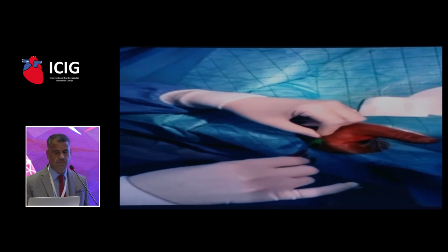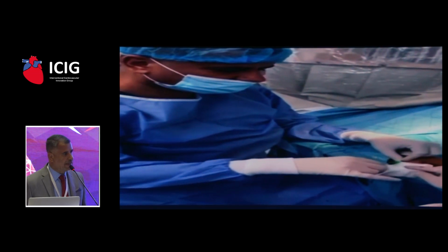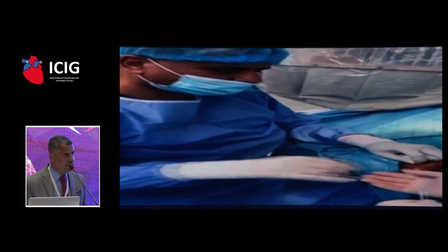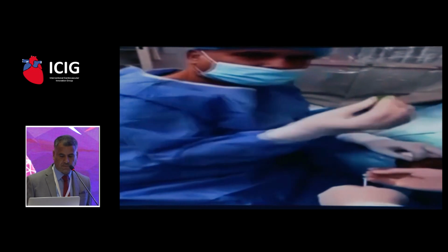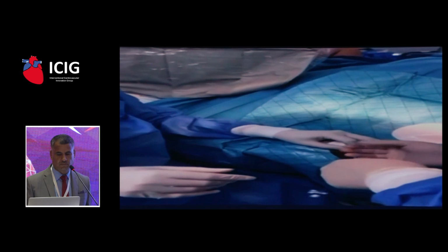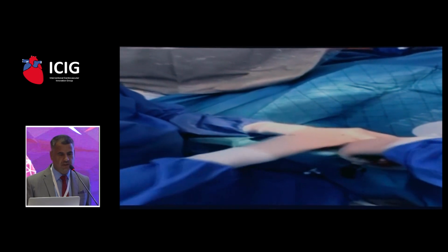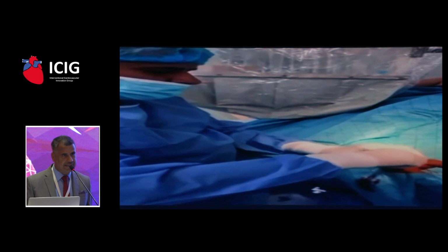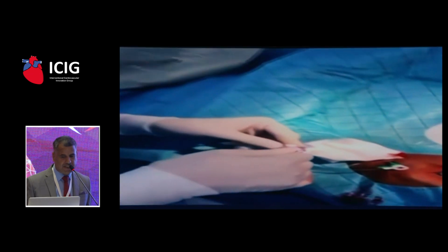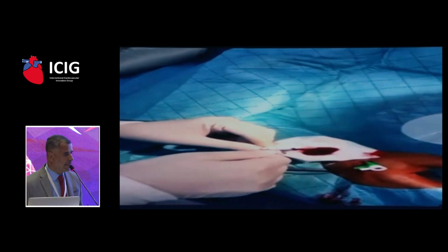Mostly I'm using a 5 French sheath for the angiography, but for the intervention, 6 French sheath and even 7 French sheath. This is a Seldinger. This is a 6 French sheath. But anesthesia is very important, because if you don't anesthetize the patient perfectly, spasm will occur, in addition to using the cocktail. Already we know it.